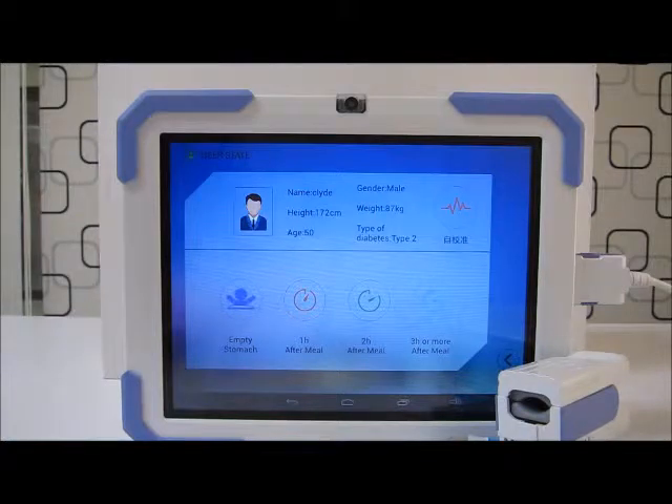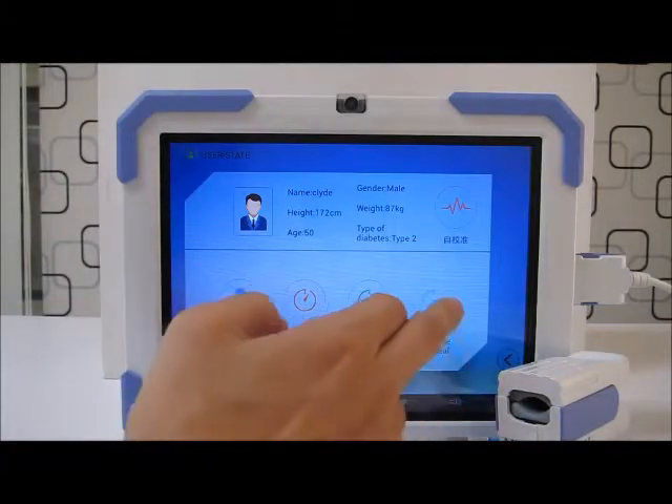Over here you can see the screen. The app system asks me how long since my last meal. Right now it's 12 noon, three hours after my meal, so I will press the last option: three hours or more after meal.